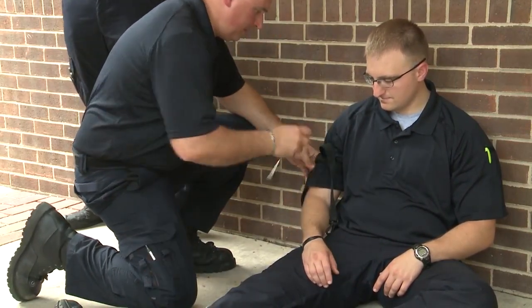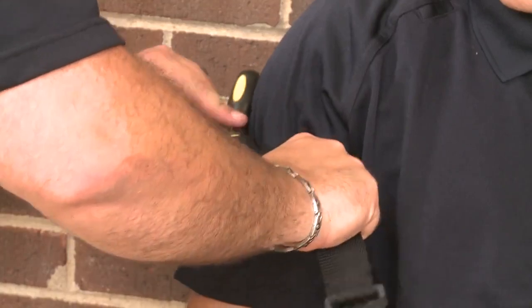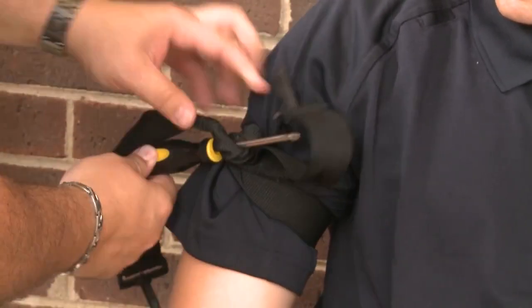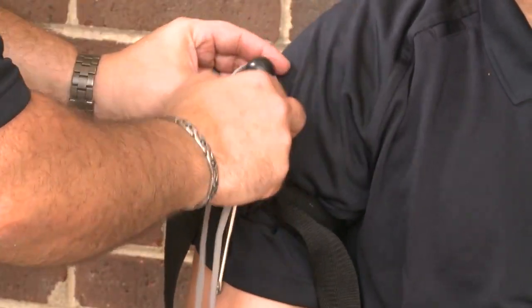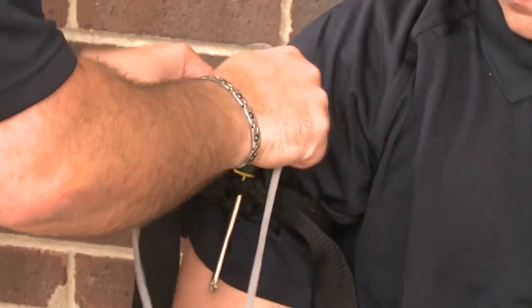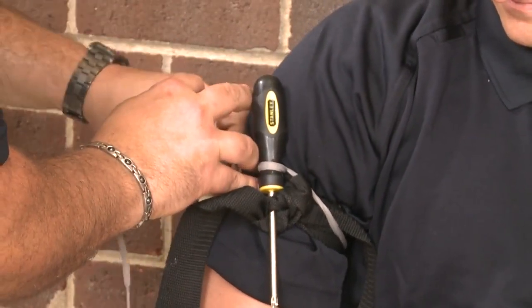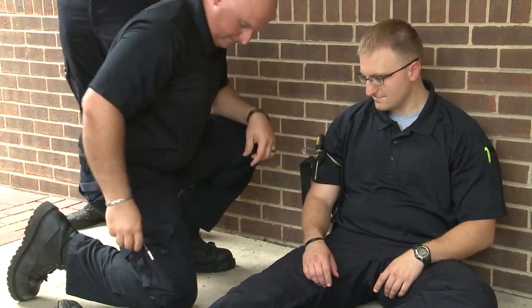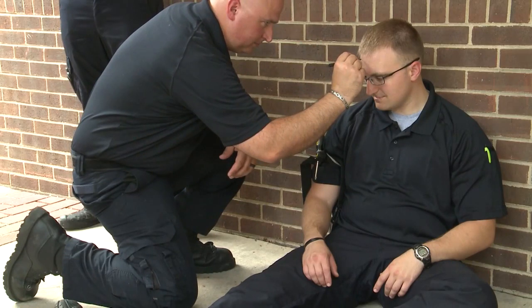Here, the strap from a duffel bag is being used. The tourniquet handle should be a solid material or bar, like this screwdriver. Twist the tourniquet handle until desired tightness stops all blood flow from the wound. Secure the tourniquet handle with a string or tape, like this shoelace. Document with a pen, lipstick, or marker the date and time the tourniquet was applied on the patient's forehead or the unaffected arm.